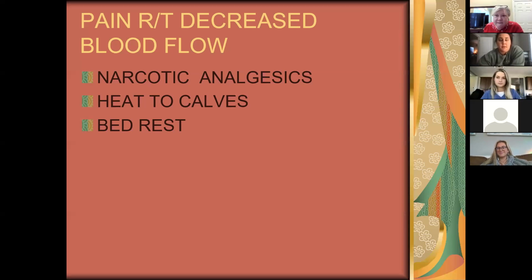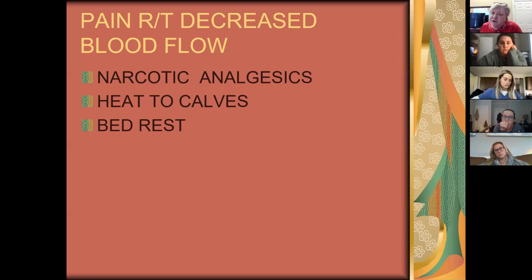So those filters that they put on IV lines, those are just for air bubbles then? Just curious. Air bubbles mostly. They also catch crystals. If you have a drug that has crystals in it, like I will talk about mannitol having crystals, and Jane will talk about Dilantin having crystals, they have to be given through a filter, either a filter needle if you're giving them push, or if you're hanging it as a drip, you have to have a filter on those because it catches crystals.